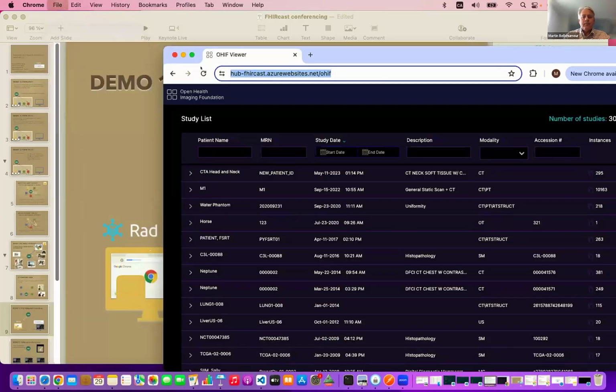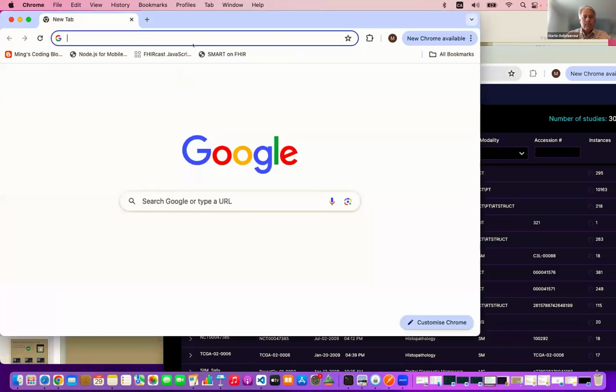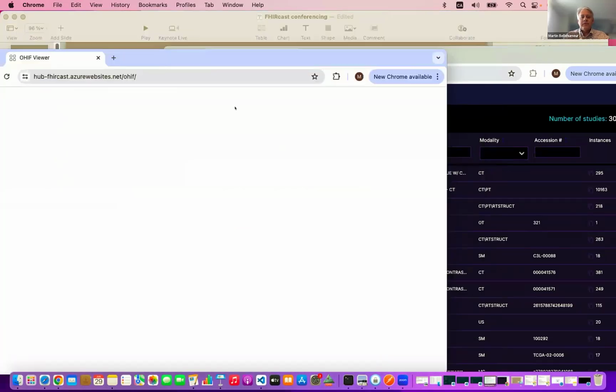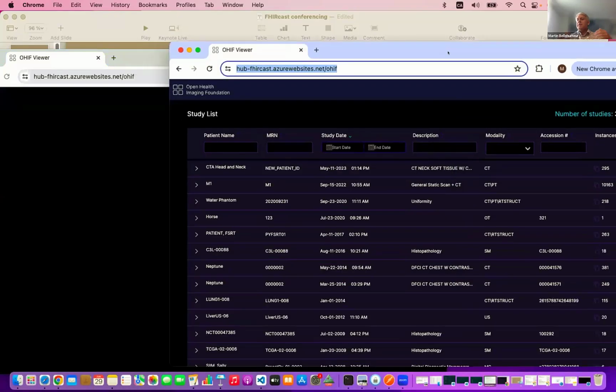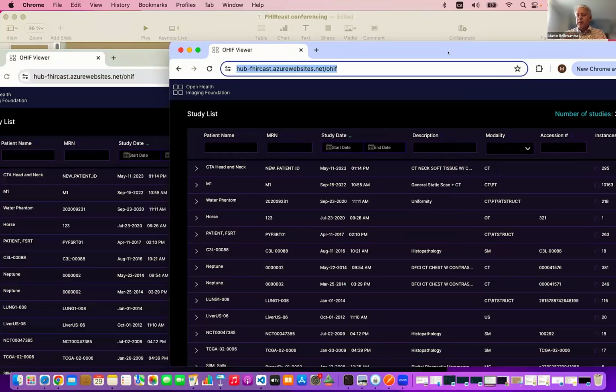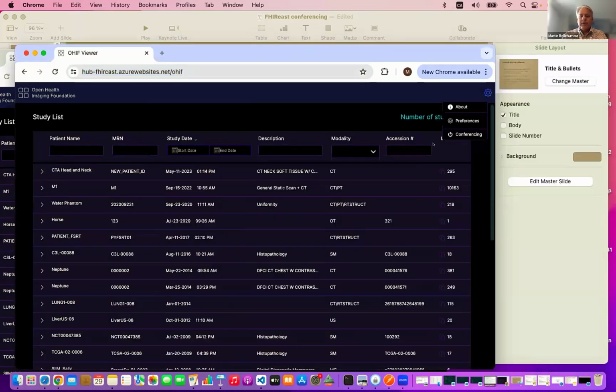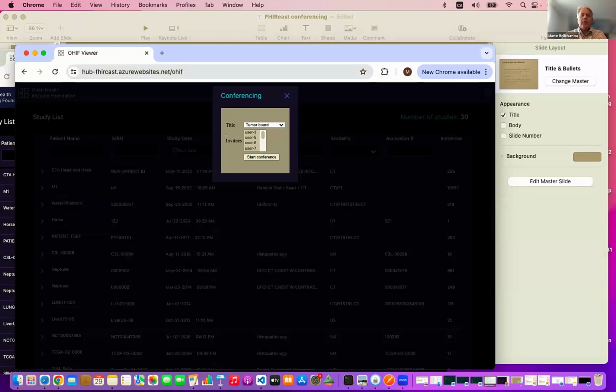And I'm going to open a second viewer. And hopefully a few of you have done the same. So what's going to happen is conferencing. It's a feature of the hub. When I open the study in one viewer, after I start the conference, it's going to broadcast that imaging study open event to all the participants in the conference. So I've got a little button here to start the conferencing. And it's showing a page that comes from the hub. This is not from the client. You don't have to notify the client.